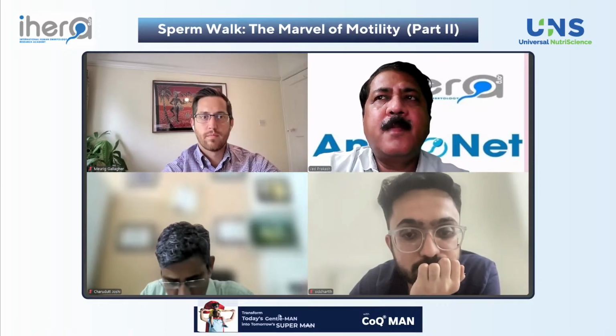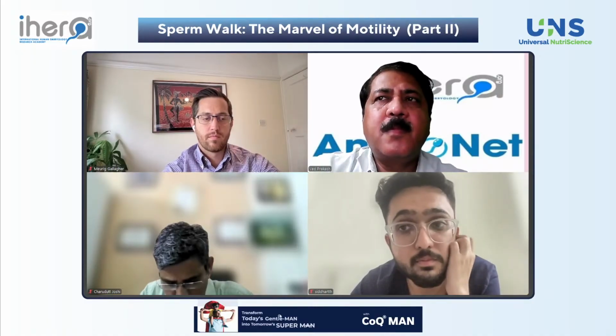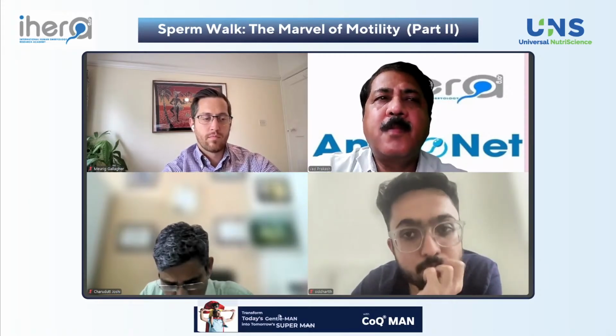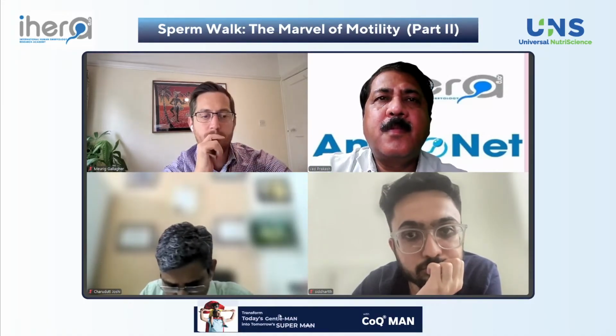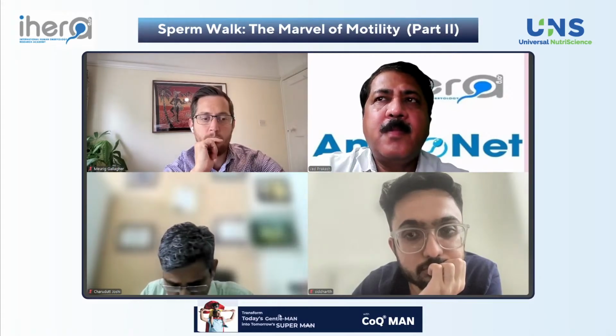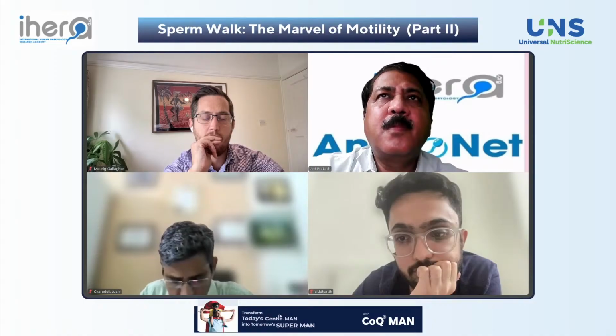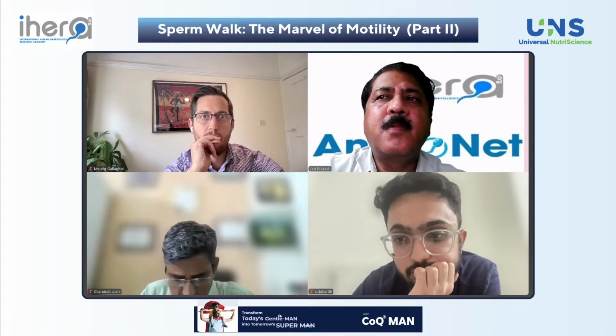And there are microdevices already in the process of being manufactured, where they are trying to get microgrooves, trying to get the sperm to move along the surfaces, trying to change the channel size, to see how the sperm moves better and how the selection can be better. But these are right now, if I'm not wrong, not available commercially and still in the research stage. So maybe in the next coming decade, there is something exciting in terms of what microfluidics can deliver, including chemotaxis and rheotaxis.